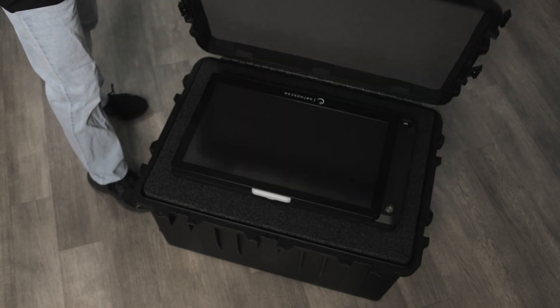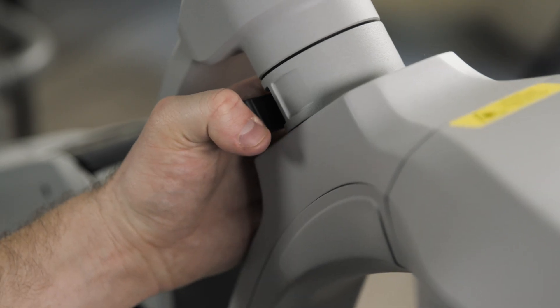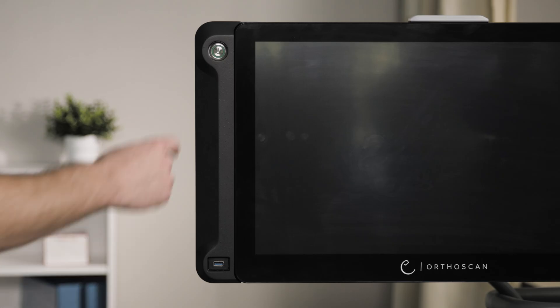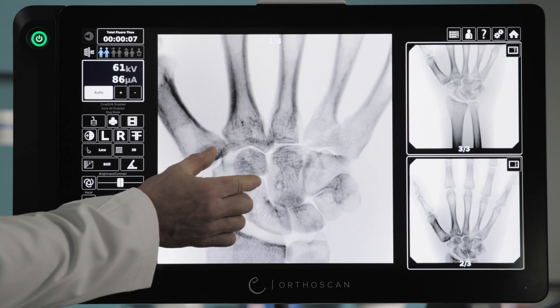Setting up Versa is quick and hassle-free. Simply unpack, mount it onto the accessory cart, and position the monitor, allowing for smooth, dynamic movement within your office. With just the press of the power button, Versa is ready to deliver real-time imaging on a high-definition 24-inch LCD touchscreen.